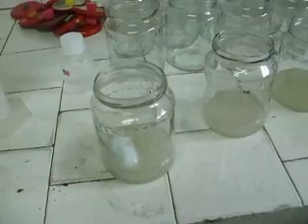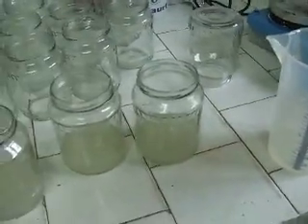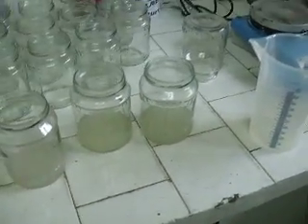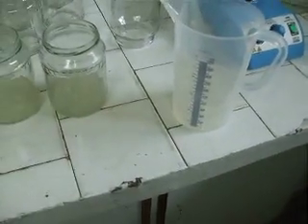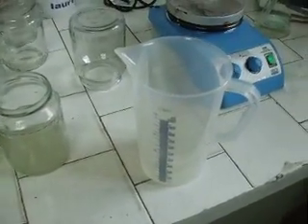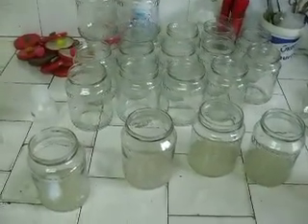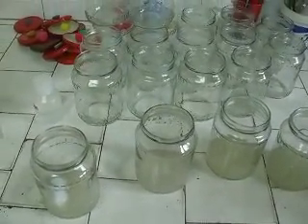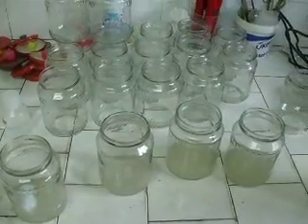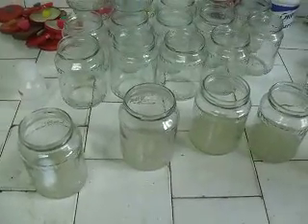So, the first thing, because we don't have a powerful mixer, the first thing is dividing the media into small amounts and then adding and mixing up the gum fast. It is essential because after we get the suspension it starts thickening very quickly, and then the medium has to be helped out with a spoon, the remainder from the inside.